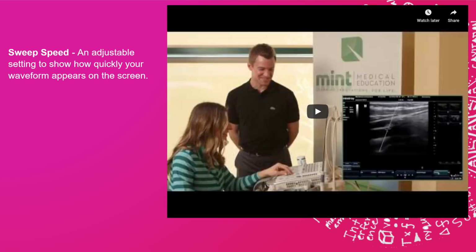Sweep speed is another control on your machine that will change how quickly the waveforms are displayed on your monitor. So this video that I have here is a training video for a system unit called MindRay, and it actually goes over a lot of that knobology that we talked about, the gain, how to move the sample volume, angle correct, all of that. So it might be a nice review video for those of you that want to review knobology and what everything does. But I'm going to start this video where they talk about sweep speed, and you'll get to see how changing the sweep speed changes how quickly waveforms are displayed on the monitor.